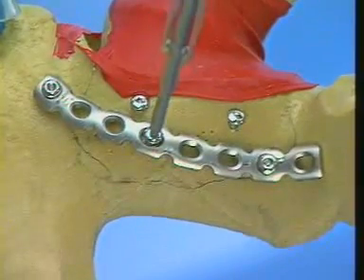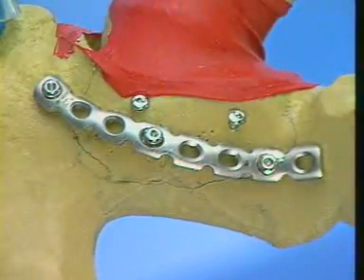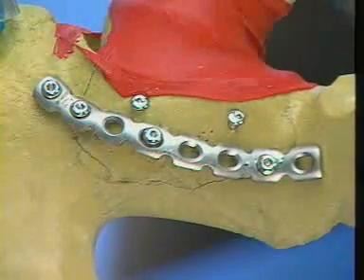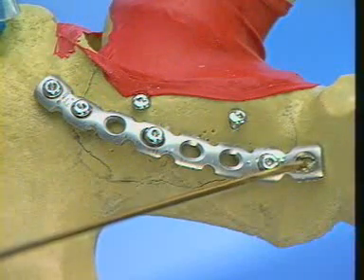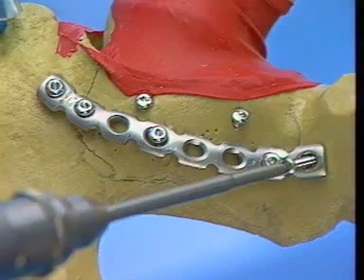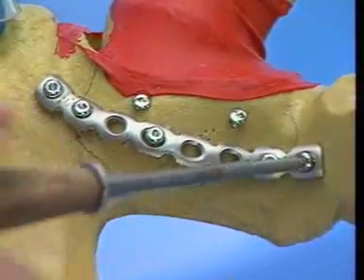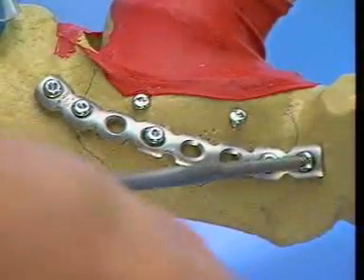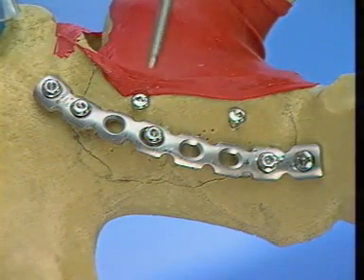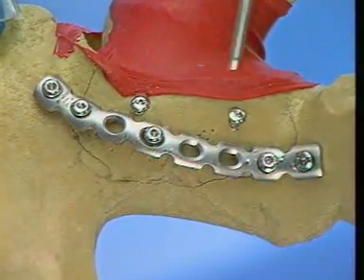Always take care to direct the screws away from the joint. Another screw at the upper end of the plate is inserted. A final screw is directed distally into the ischium. The lag screws in the posterior wall may now be fully tightened if they have not been previously.